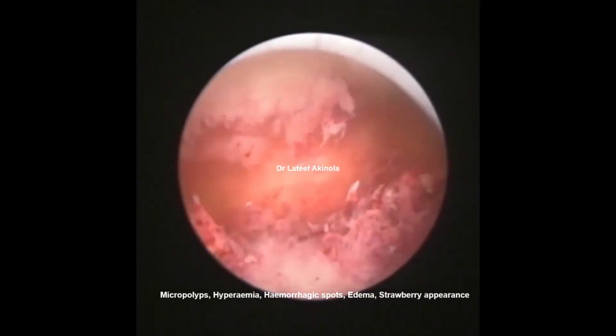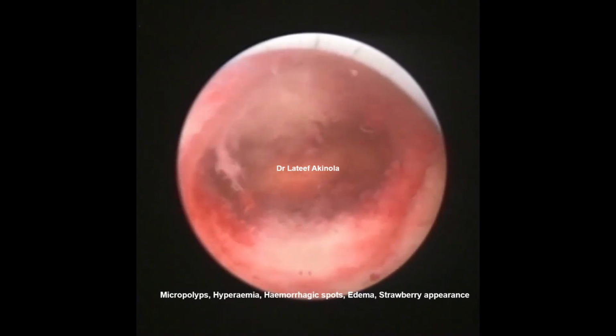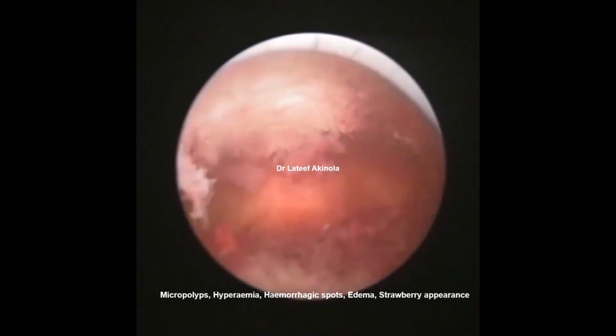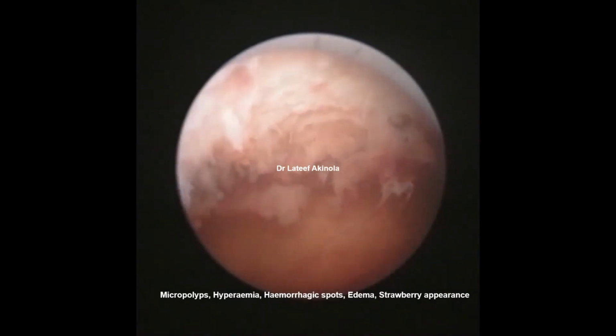This video demonstrates numerous micropolyps, strawberry appearance of the endometrium, interstitial edema, hemorrhagic spots, and hyperemia. Close to the end of the video, a gentle manual vacuum aspiration was done and the sample sent for culture and sensitivity and histology.